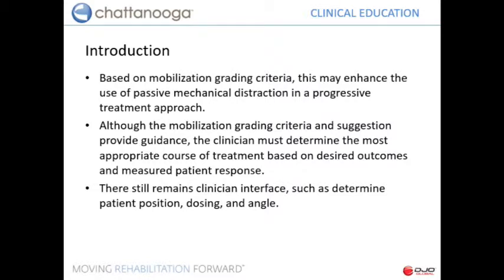So when we look at not only the duration of the hold patterns, you would also have to take into consideration how quickly you want to transition from one level to the next, as well as the overall amount of intensities. In a moment here, I'll pull up Maitland's grading criteria for mobilization and give some indication as to why.